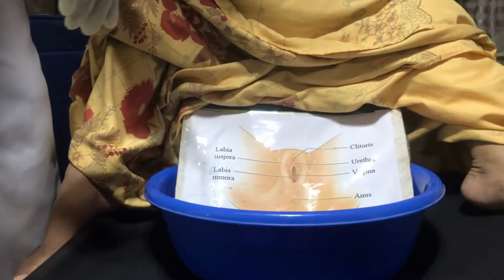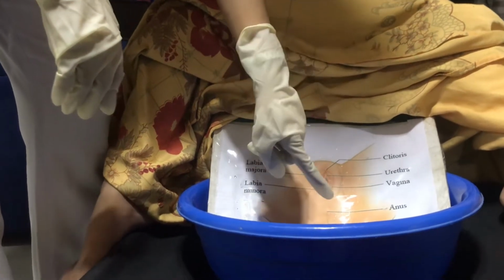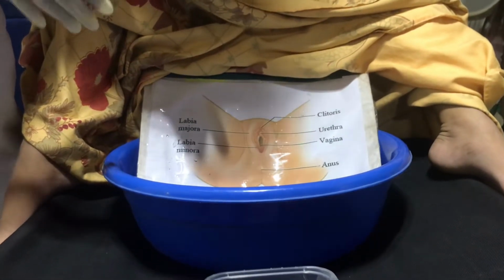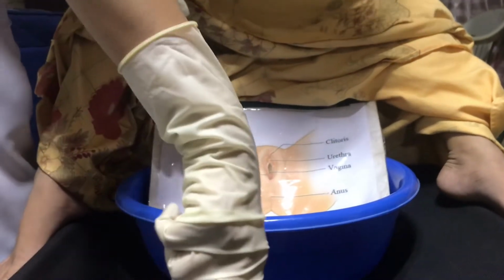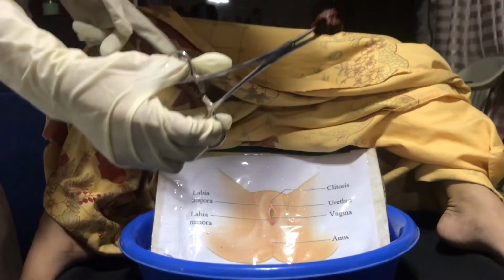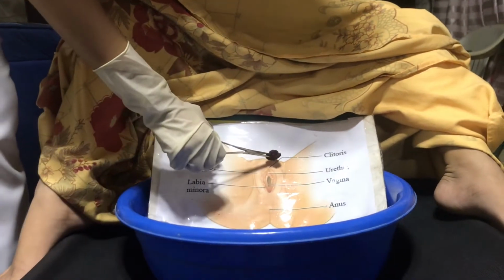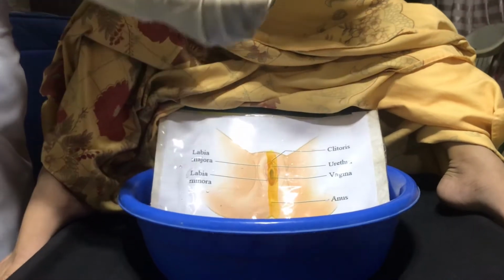So next is that we cleanse the external genitalia starting from the midline of the symphysis pubis down to the anus. Never retrace a stroke. The rationale for this is to prevent contamination of the area. Alright, so this is our working forceps, and we need to get the first cotton ball that is soaked in cleansing solution. So from symphysis pubis down to the anus, then discard.